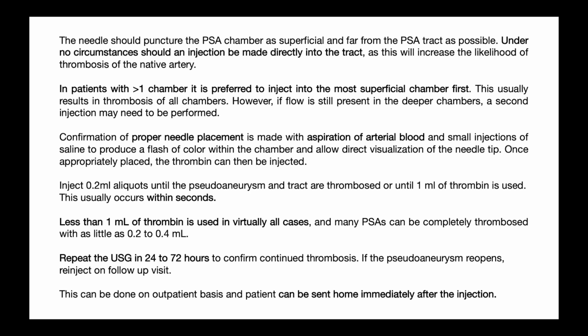Repeat the ultrasound in 24 to 72 hours to confirm continued thrombosis. If the pseudoaneurysm reopens, re-inject on a follow-up visit. This can be done on an outpatient basis, and the patient can be sent home immediately after the injection. I'll now show you two cases that I've taken from the internet, but I thought they had good learning value. So let's see those two cases.